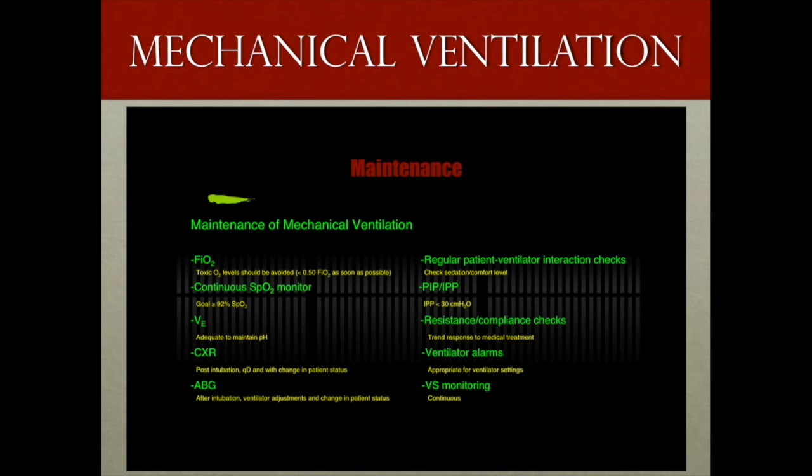For maintenance of mechanical ventilation, things that you want to check each day are your patient's FiO2. And we care about their FiO2 for several reasons. One is because high levels of FiO2 will lead to accumulation of free radicals, and also because high levels of FiO2 will actually end up causing ARDS.